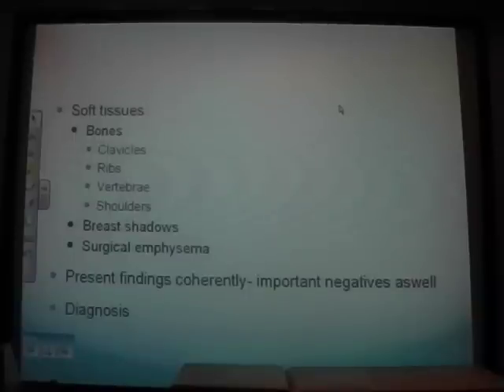The main thing is, this is a 62-year-old gentleman that's come in with, I don't know, cough and shortness of breath. This is an AP chest radiograph, or chest film, which shows right lower lobe consolidation. That's it. That's all you need to know. Okay. These findings are consistent with community-acquired pneumonia. Yeah, that'd be really straightforward.